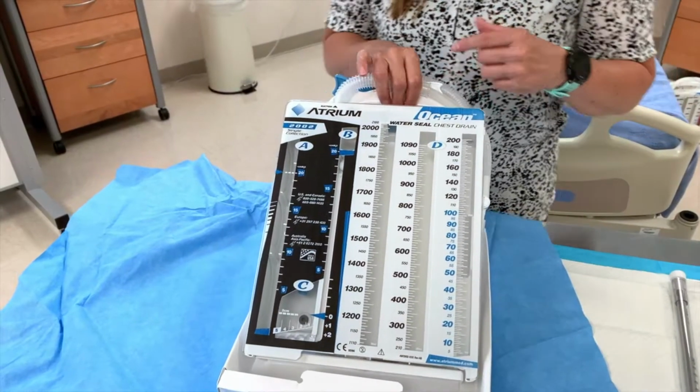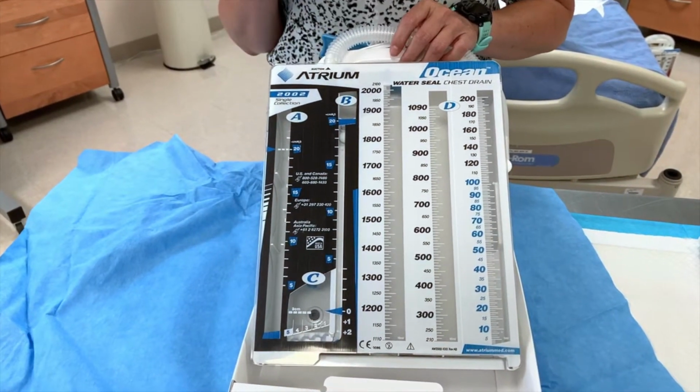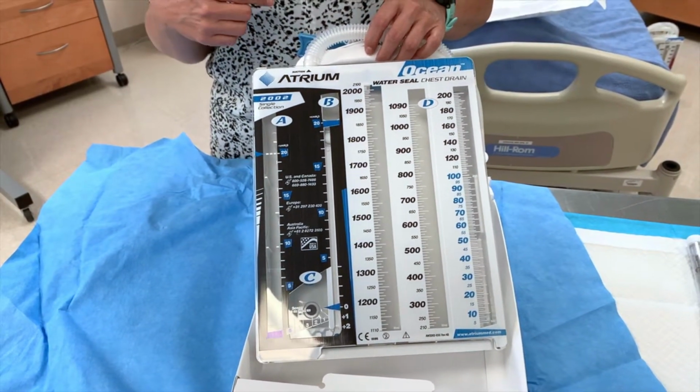Now let's look at the different types of chambers that we're going to be monitoring as we take care of our patients with a chest tube, because monitoring of these chambers is going to help us understand and recognize if the patient's having any complications.